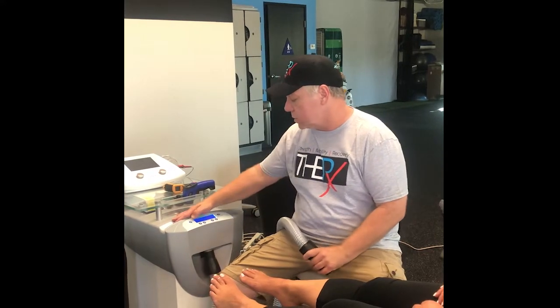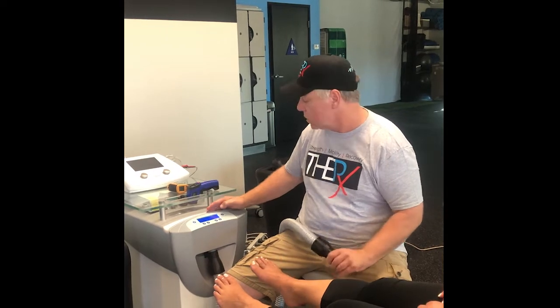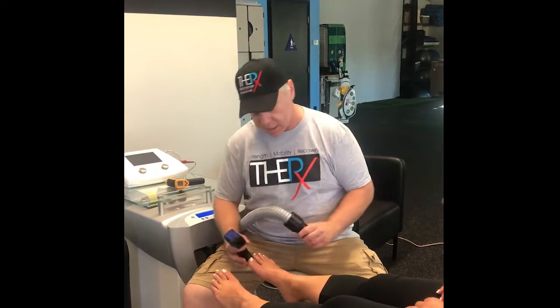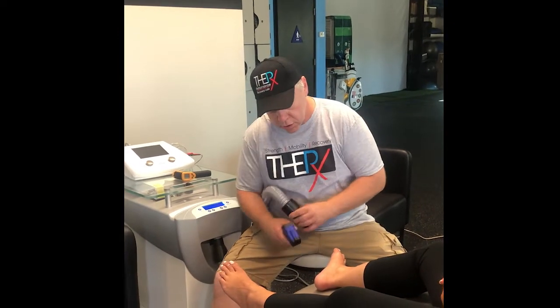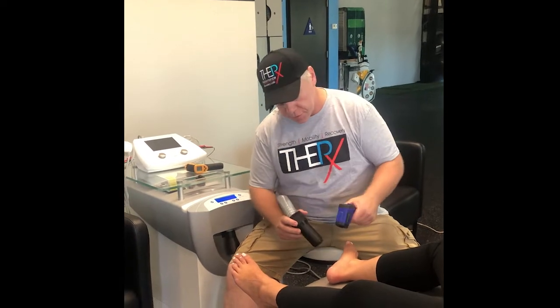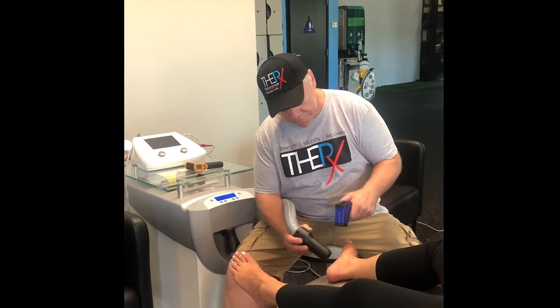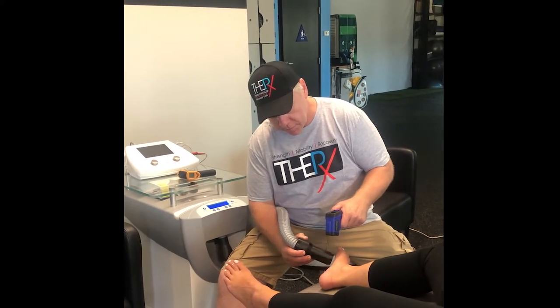Let me show you how it works. For plantar fasciitis I like to go up to about a seven. We use the thermometer because we want to get the skin temperature down to a certain temperature. Her skin temperature currently is 30 Celsius. And then we'll go back and forth covering the plantar fascia.